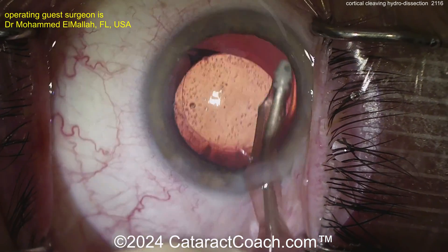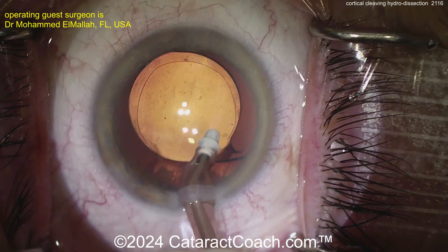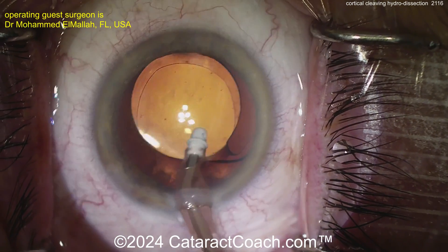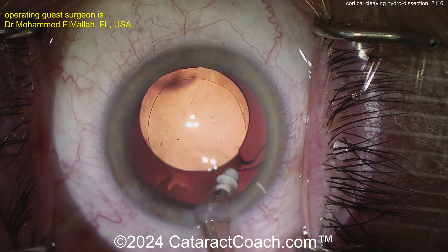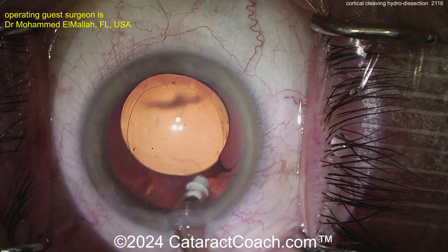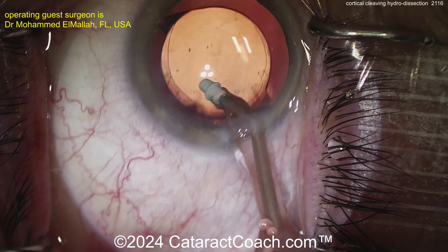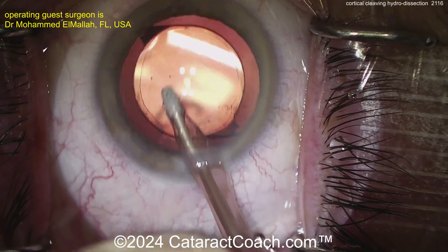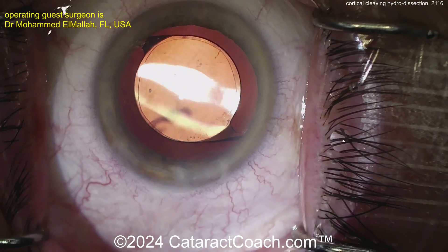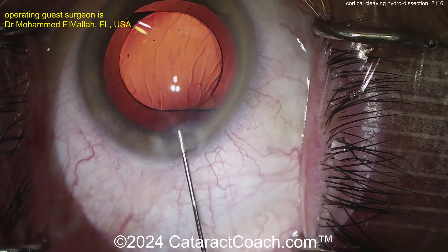There's polishing of the anterior capsule rim — a nice-looking case. Getting the lens centered, with a generous capsulorhexis that overlaps nicely. Wow, look at that floater — a big Weiss ring in the vitreous. The patient is complaining about floaters, and with something like that I'd complain too. It's tempting to just put in a trocar and go get it, but we'll leave that for another date.